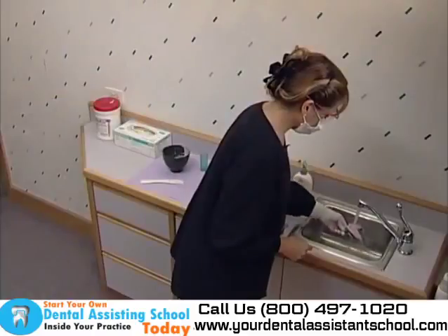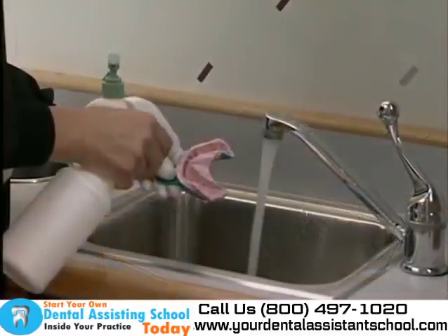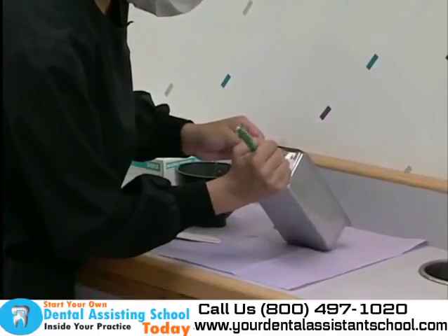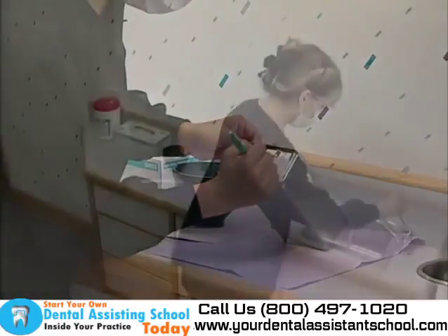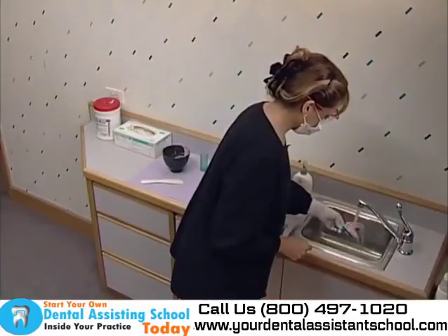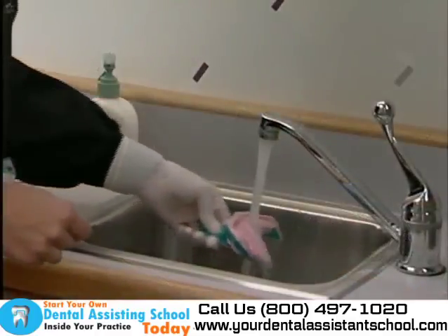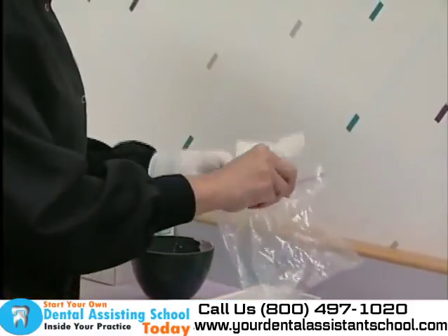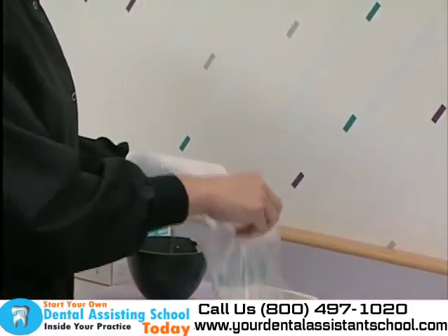The impression tray is then rinsed, disinfected, and placed on a tray, making sure the patient's name and the date are noted. If the impression is not to be poured immediately, it should be rinsed, disinfected, wrapped in a moist paper towel, and placed in a sealed plastic bag or humidor.